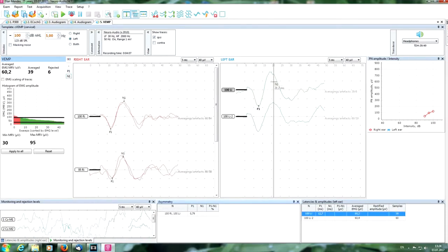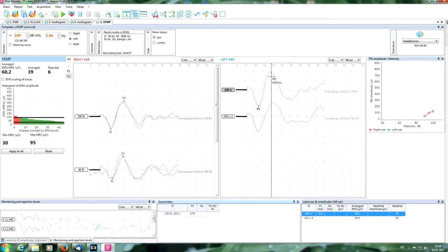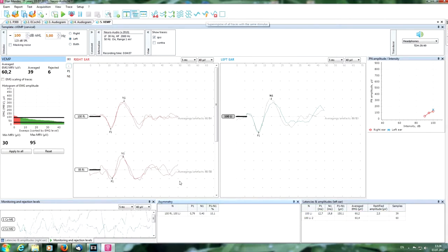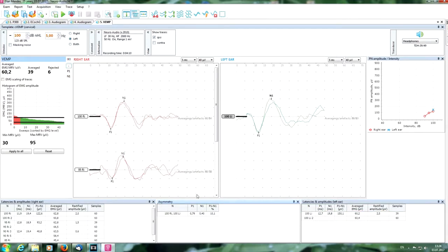Okay, overlay. If you want, you can see in this table the asymmetry percentage. In normal it is within 50 percent, which is normal here.